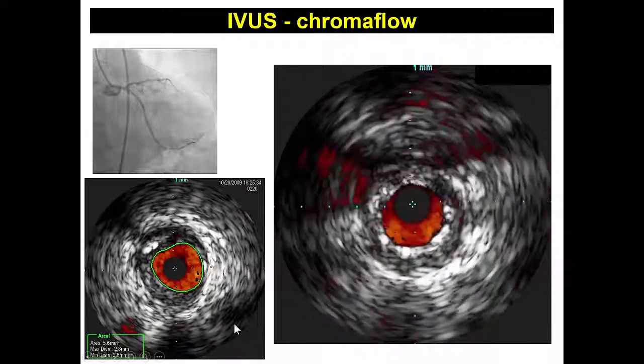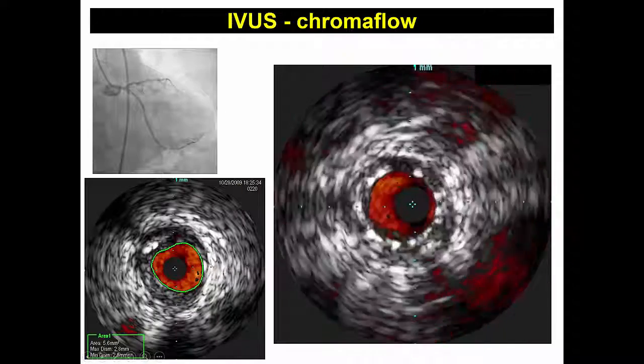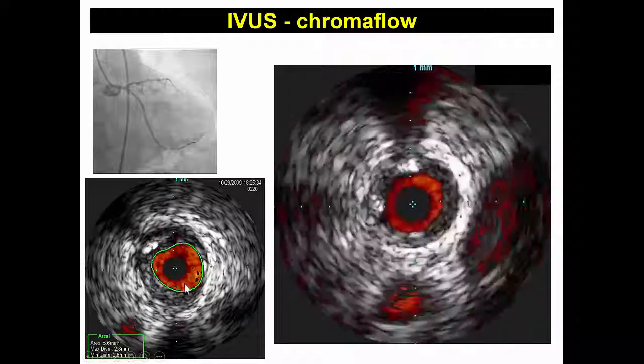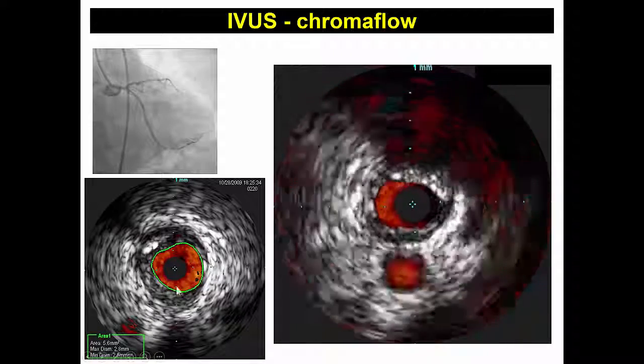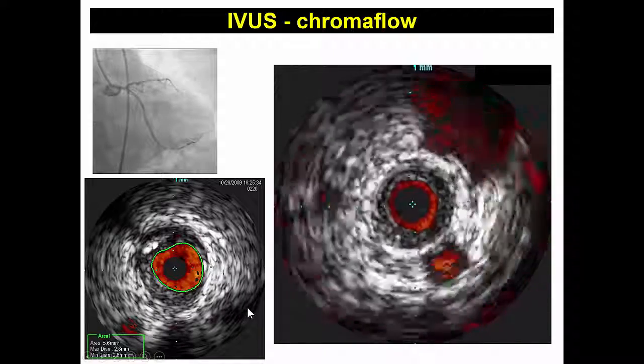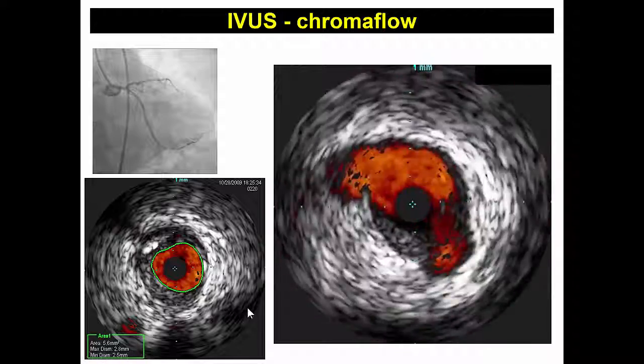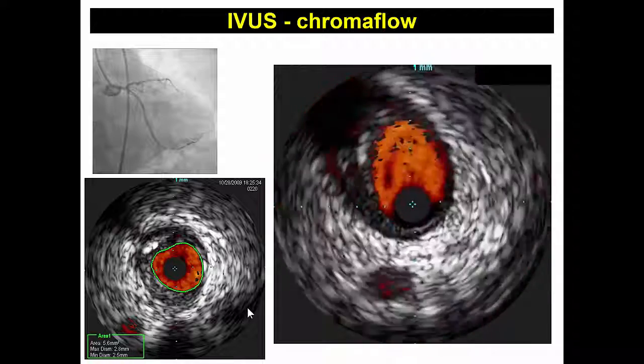We also did intravascular ultrasound, which demonstrated that the area of the left main was 5.6 mm squared, suggesting severe left main disease.